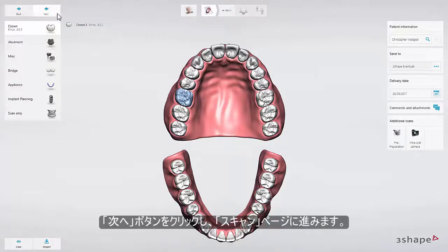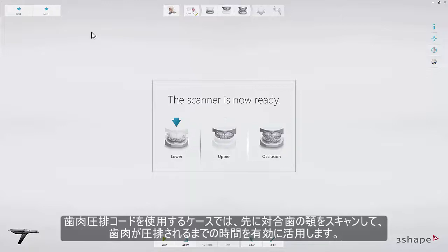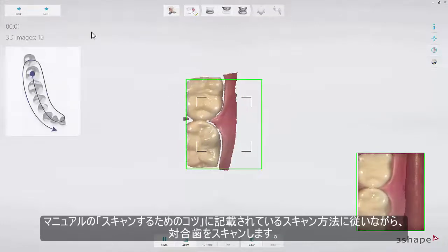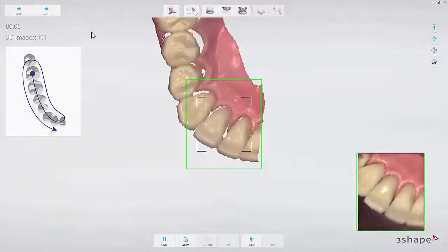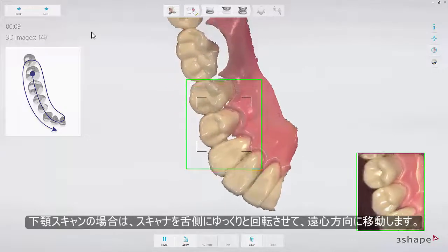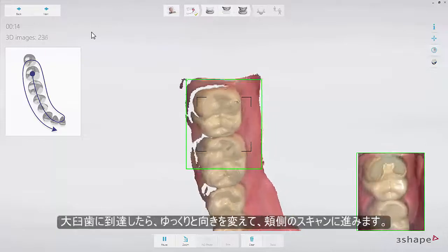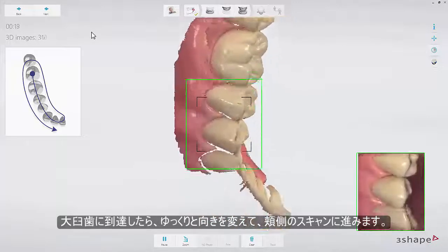Now proceed to the Scan page. Use retraction cord and/or hemostatic agent if parts of the margin are subgingival. In this case, start by scanning the opposing arch to allow time for the retraction methods to take effect. Follow the official scan strategy: start by scanning the occlusal surface from the molar to the canine. Then, as it is the lower arch, slowly roll to the lingual side and move the scanner to the distal direction. Finally, slowly roll over the last molar and scan the buccal side.